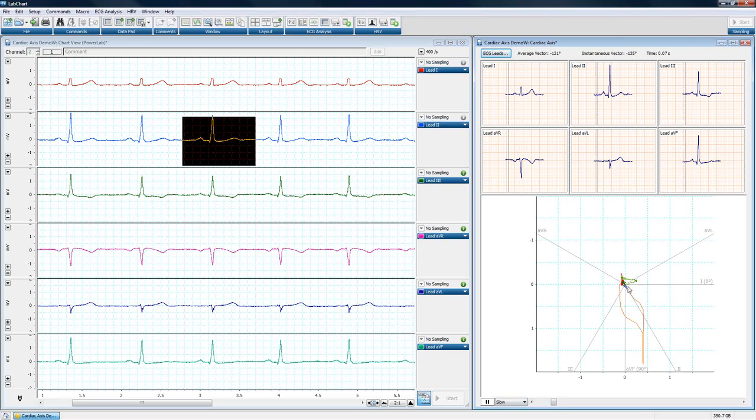And you see our instantaneous vector is a green arrow that's pointing up right now. We're not doing anything. And then once we start getting into the P wave, you'll see it follow this blue loop right here, if you can see that in the webinar, maybe not. The vector changes, starts pointing down. We actually have our degrees here as well. Go through it, then we start going out into the QRS complex. Go through, recover, and the ventricle repolarizes at the T wave, as we saw before.